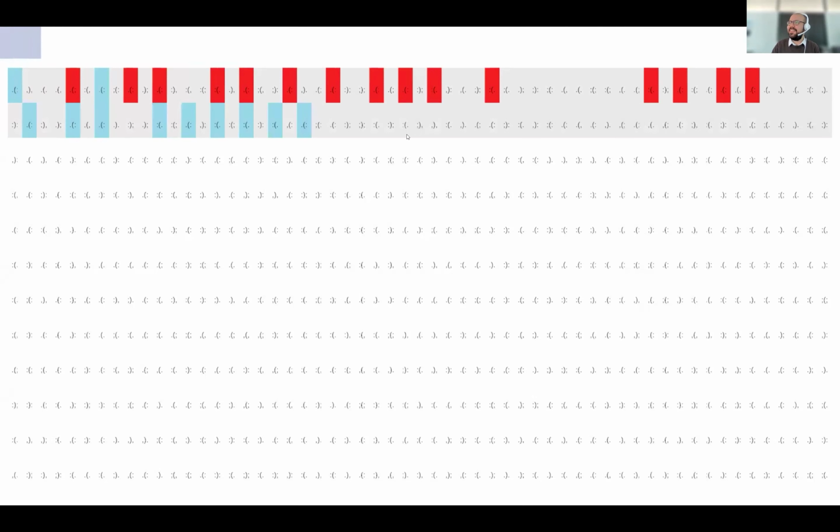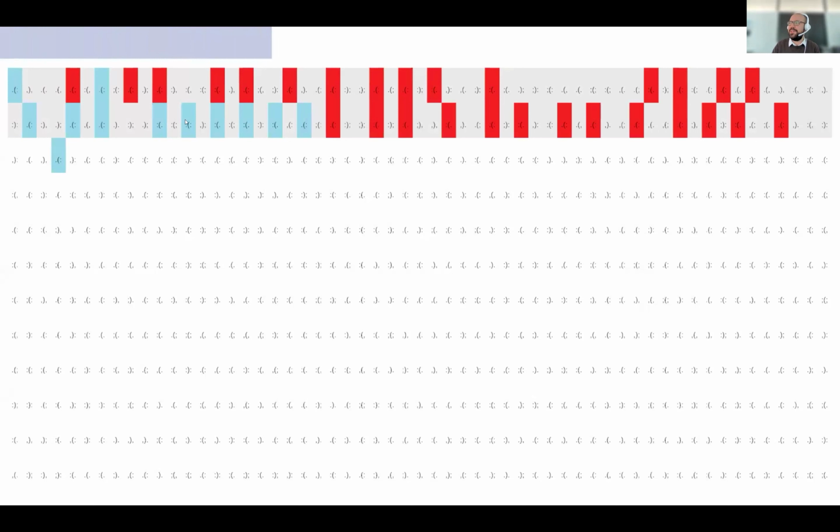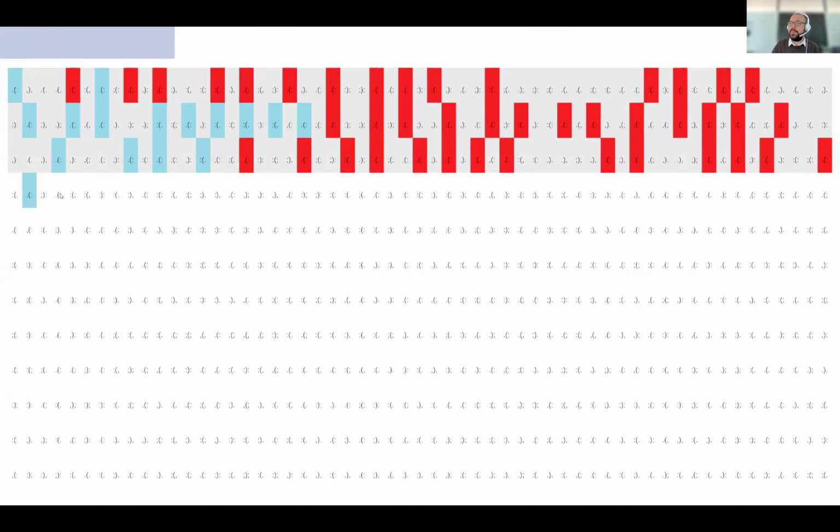And right now I cannot click it. And when I go to the next one, you will see all the other items that I have failed. And this will repeat for around 2.5 minutes. That's how long this task takes, because we're having the different bars popping up.